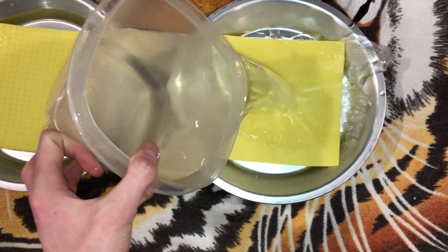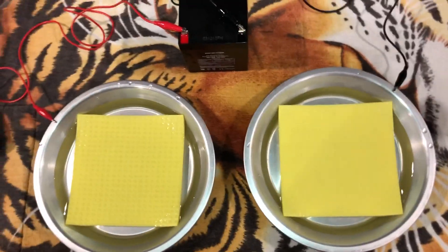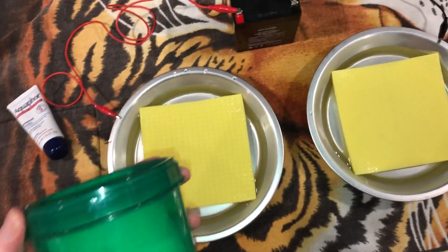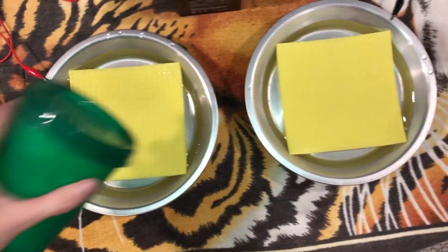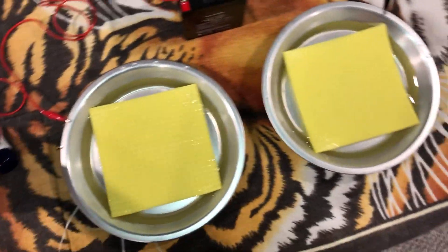Then you're going to put out some salt. It doesn't really matter how much you put in — just make sure it's a decent amount.